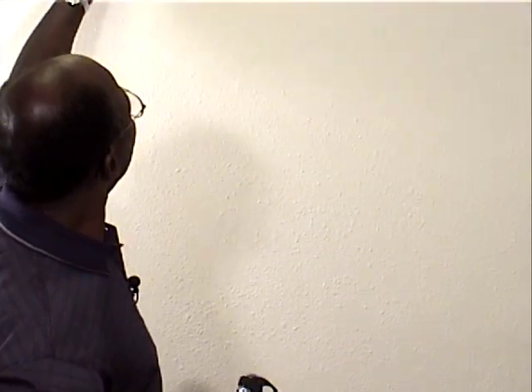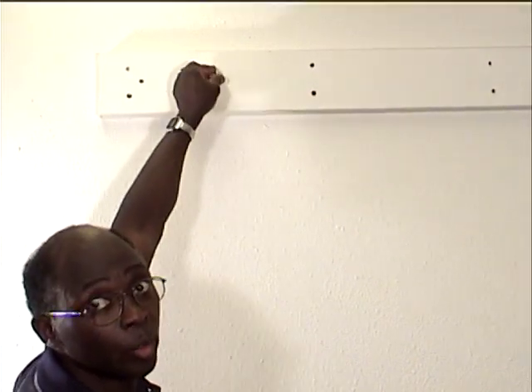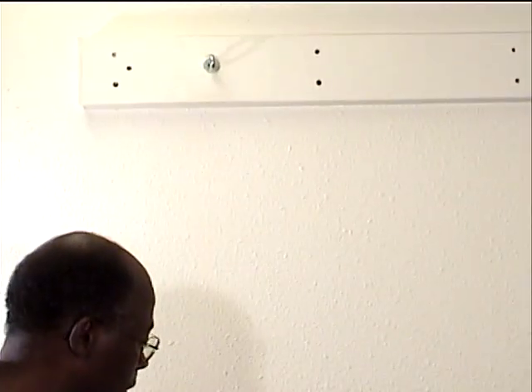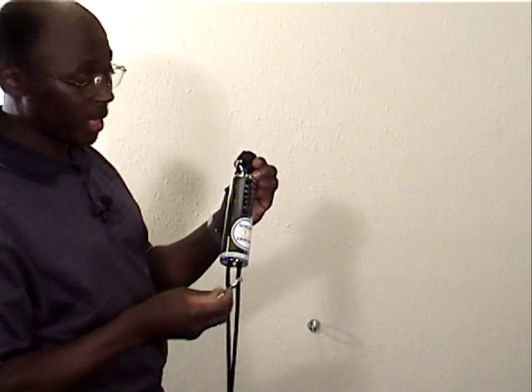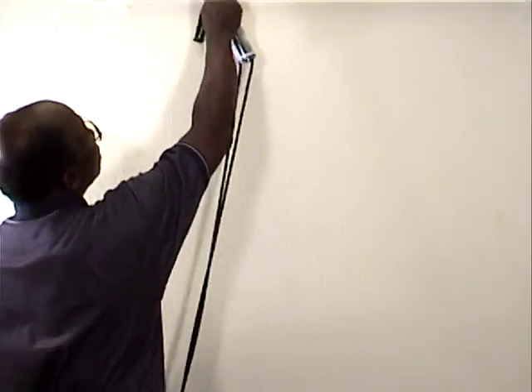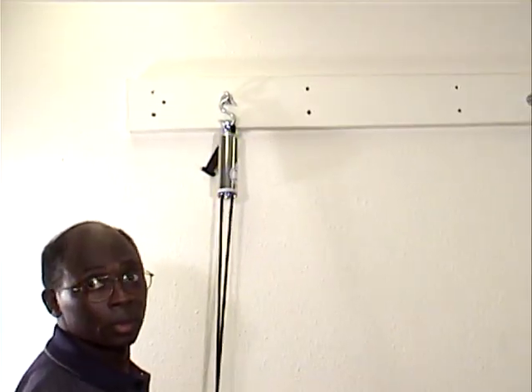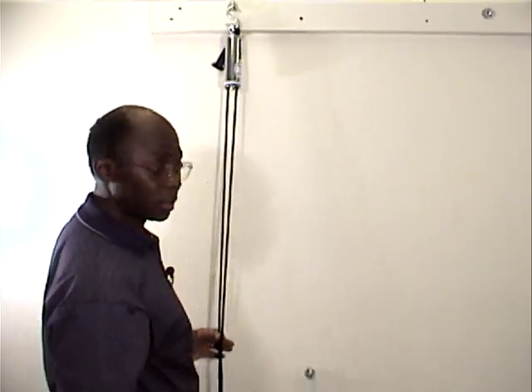Another way to attach the isoerobic exerciser is with eye bolts and S-hooks. You can use a board nailed into the wall at the studs with screwed-in eye hooks, or go directly into the studs with the eye hook. Then take an S-hook, attach it to the top of the exerciser, and attach the S-hook to the eye bolt. We'll use the eye bolt system here because it gives us more space to work.